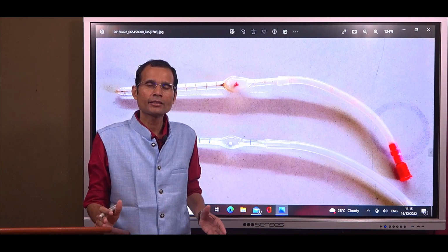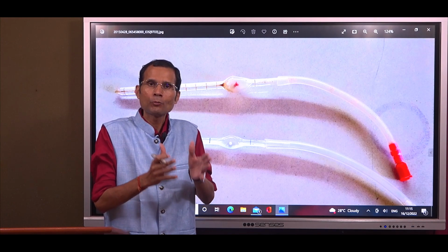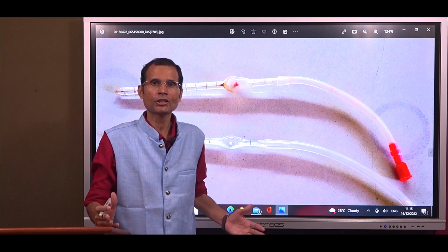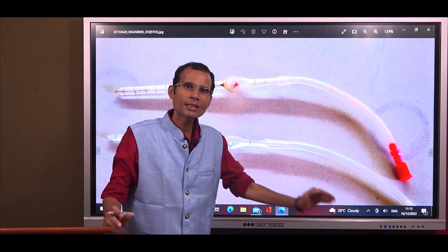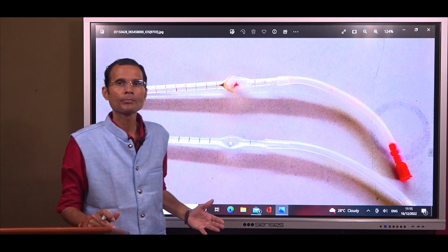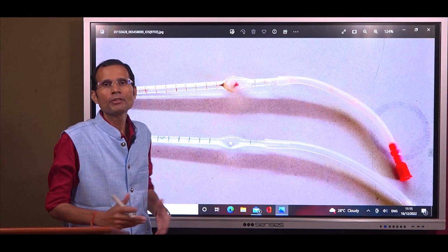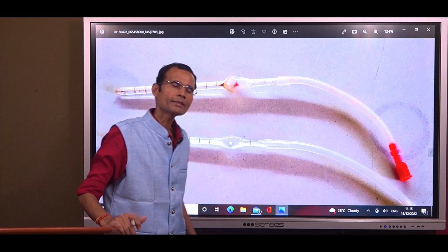If that is the case, the WBCs will be crowded too much in 1 cubic millimeter of blood. Therefore, you will need a greater dispersion, and in that case you will use the RBC pipette to count the WBCs. So remember, whenever the WBC count is too high, for example leukemia, we will have to use the RBC pipette to count those WBCs.